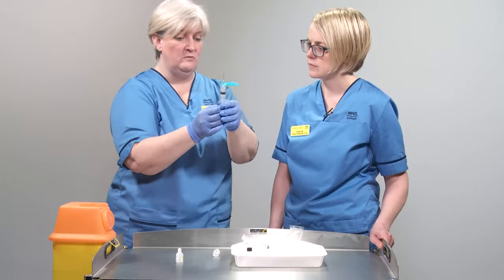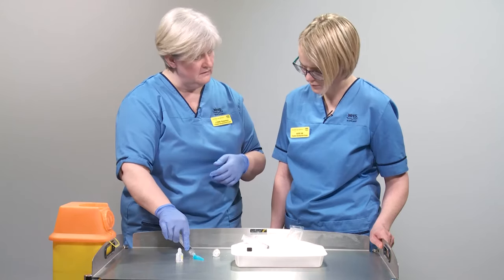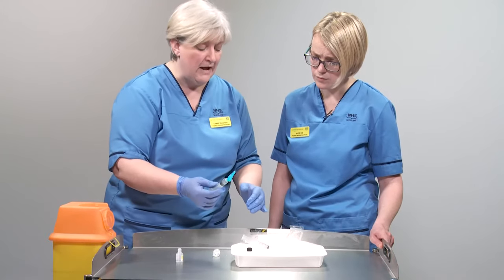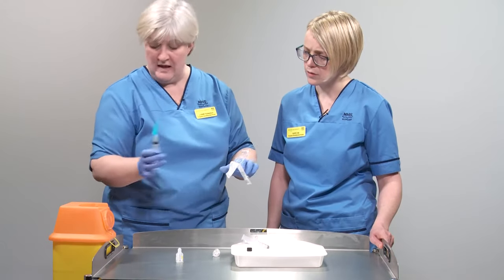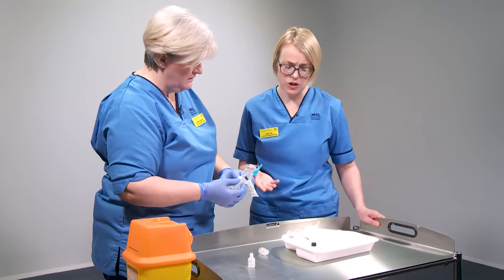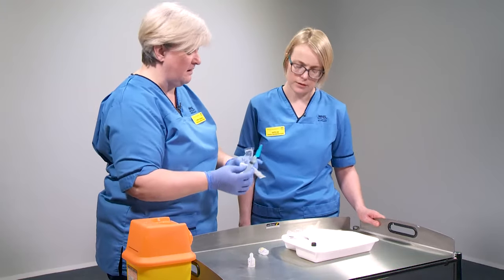That's the bolus administration ready to go to the patient. To get it to the patient, activate the safety device on a hard surface — don't use your thumb, as you could slip and get a needle-stick injury on the tip of the needle. Two options: keep the needle attached so you know which is the flush and which is the medicine, or remove the needle into the sharps bin and use the packet to protect the syringe tip. Those key parts are all protected and covered at all times using non-touch technique.